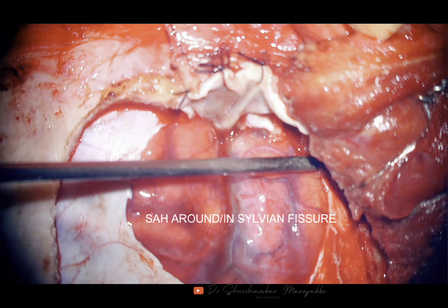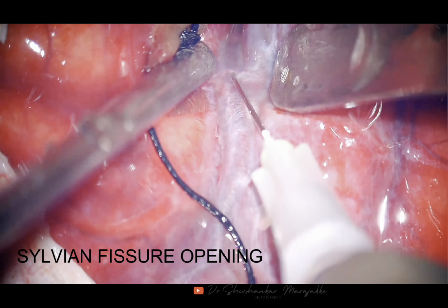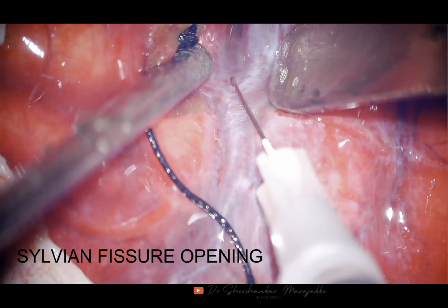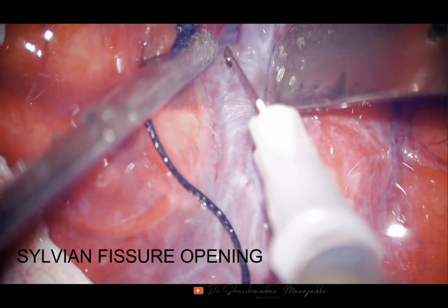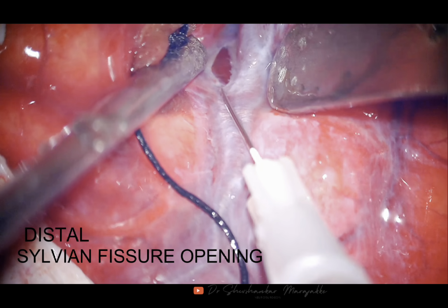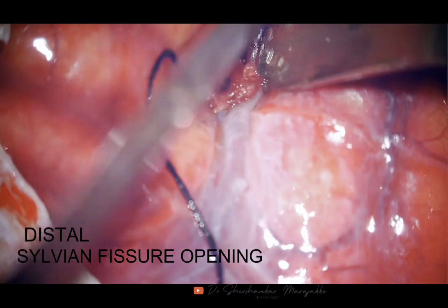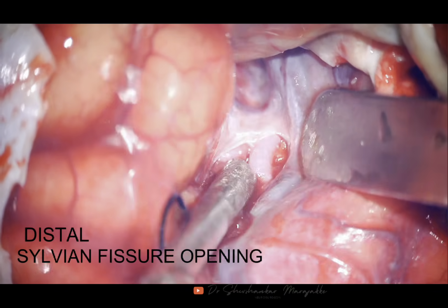So this is the sylvian fissure. We can see the brain is quite full. There is SAH around the sylvian fissure. So I am just opening the distal part of the sylvian fissure here. As you know, the aneurysm is quite proximal. This is the M1. So just to relax the brain, I started dissecting from this side, and you can see there is SAH. Then I move forward.